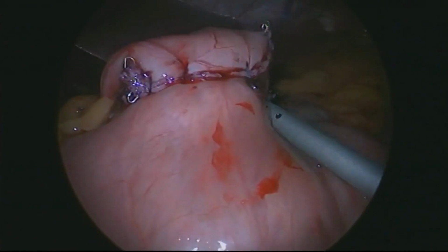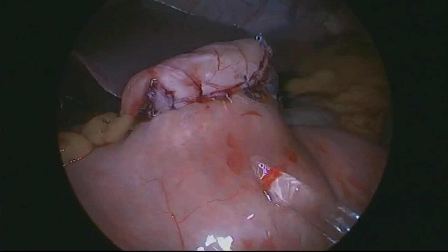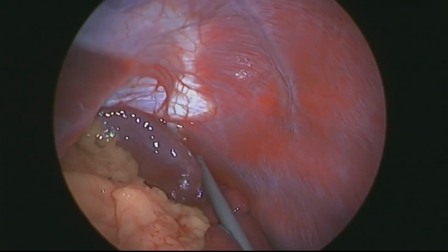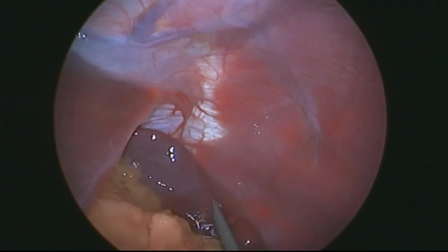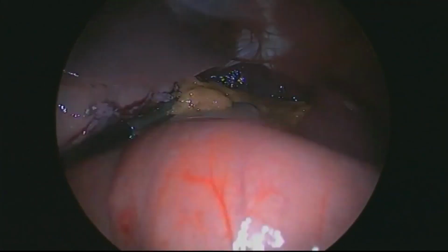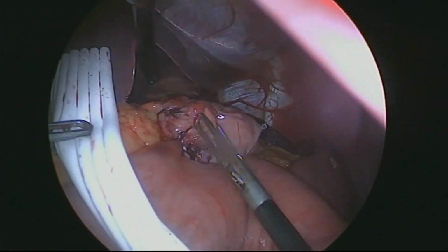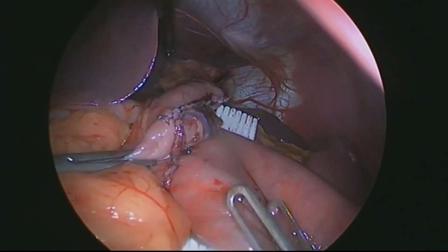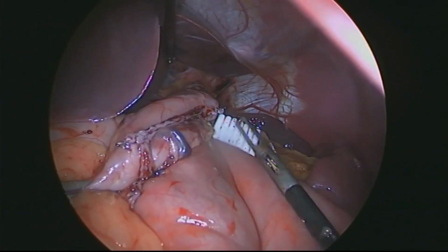So here, the anesthesiologist is working with the orogastric tube. We see the spleen here, and here we see that both limbs nicely fill up with air, which means that there's no obstruction. There's also no bubbles. And we still leave a drain.